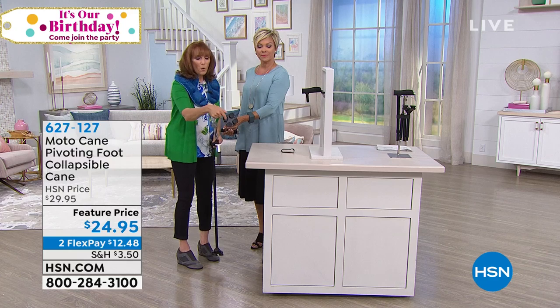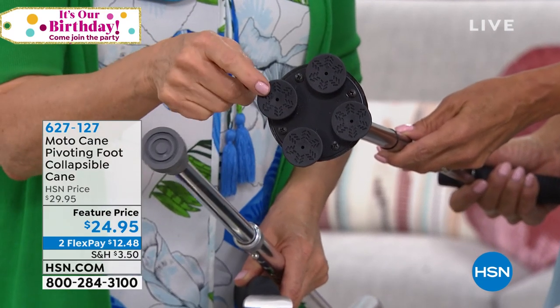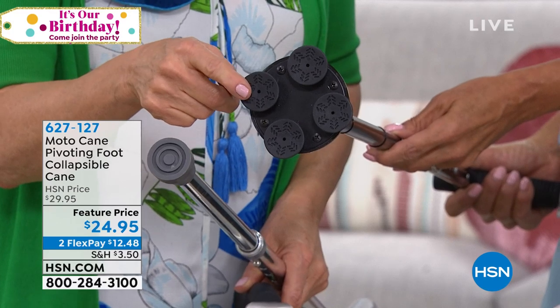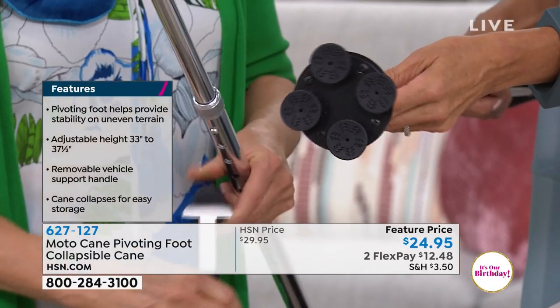The Moto Cane has four points of contact and they're grooved. So whatever terrain you're on — this is all terrain. Doesn't matter if it's gravel, rocks, cement, grass, or rain. This grabs the ground with four points of contact and makes you feel secure.